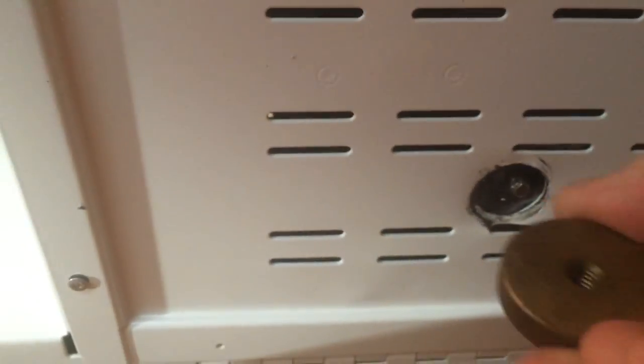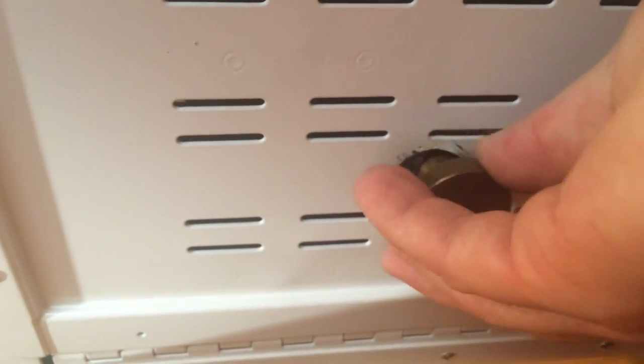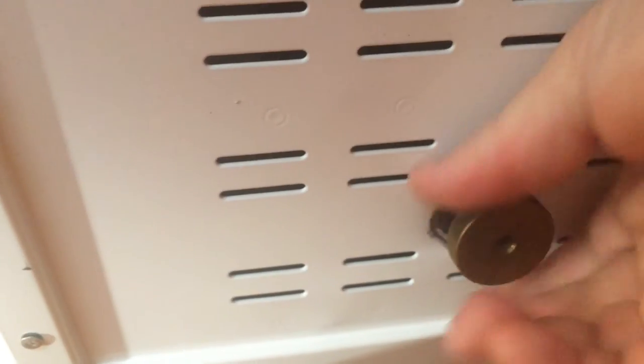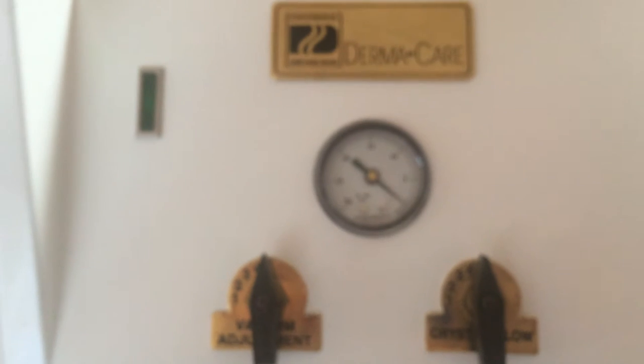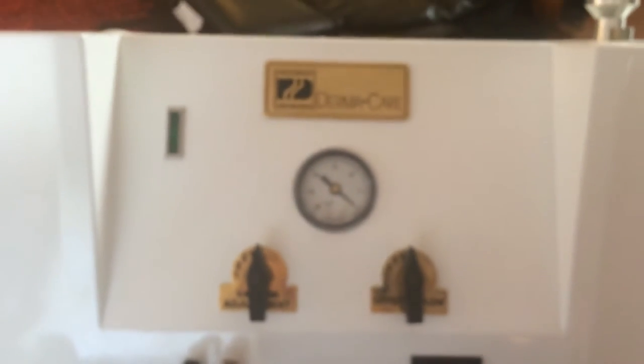Here on the bottom is a spot where we have what we call the packing bolt. It looks like this — brass — or there's also a big black plastic one. When you're shipping one of these units in for service or just transporting it, you want to screw that in all the way. It secures the motor mount in place so that the motor, which is a heavy portion of the inside of the machine, doesn't break. So you want to make sure you do that.